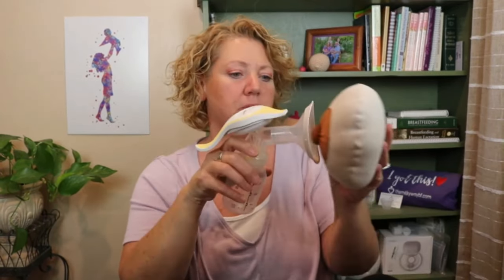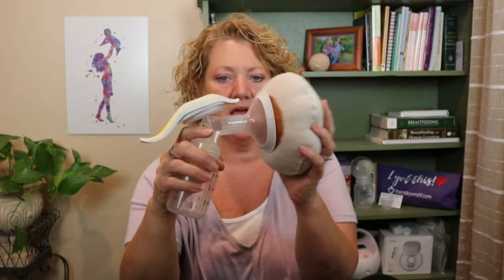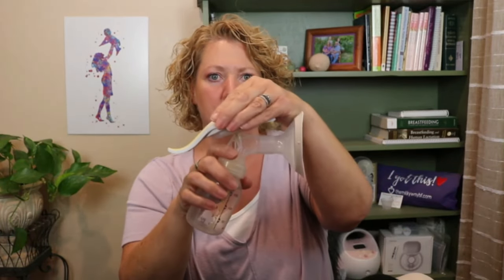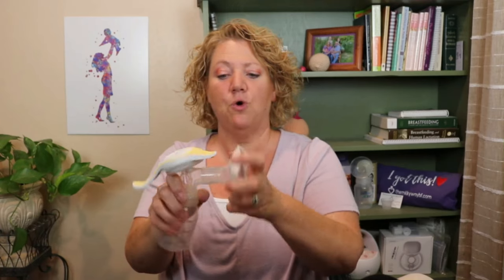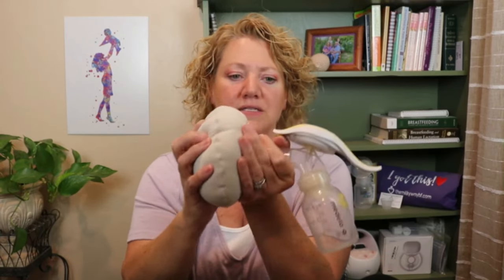When you put your pump on the breast, your nipple should be centered in the middle of the pump when you start. You don't want to hold the pump by the handle — you want to hold it by the flange. Your hand will be on the outside of the flange, holding it on your breast.